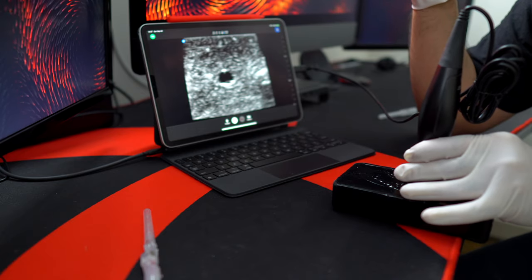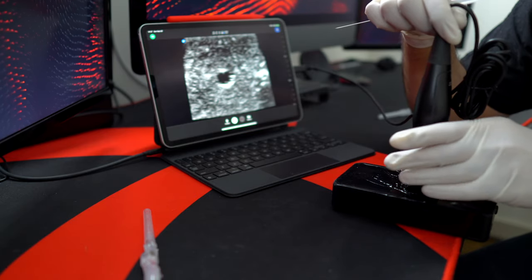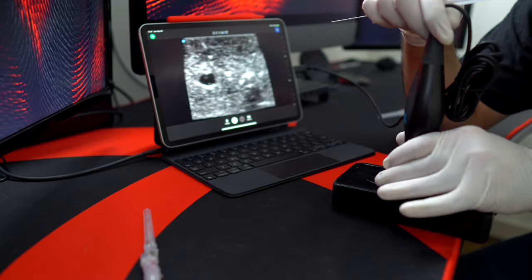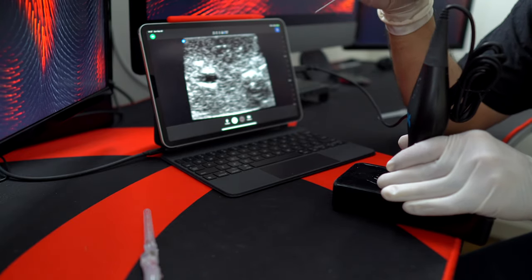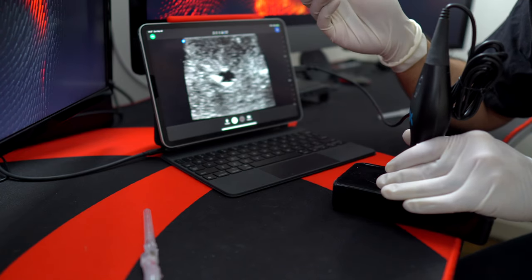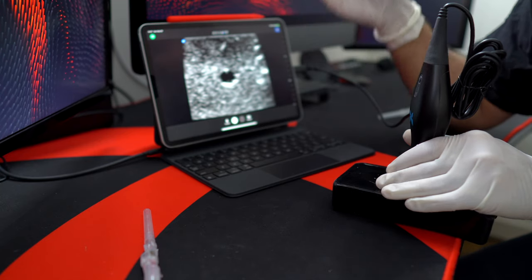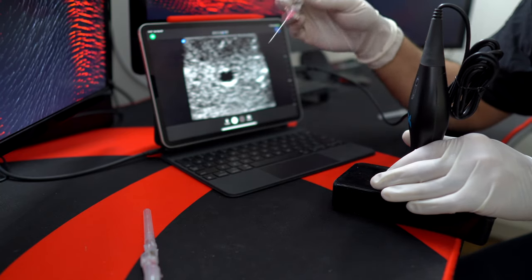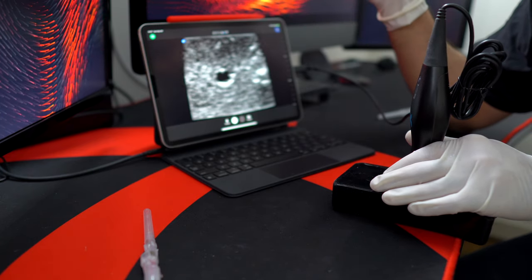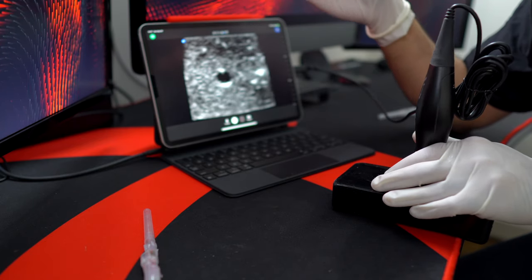The last thing I want to do before actually sticking is stabilize my wrist. If I'm working on a patient, I grab the ultrasound and use their body to stabilize my hand. This hand should not move at all during the procedure. You don't want both your needle and ultrasound moving simultaneously — only one at a time. Now I've got a good target on the screen, my wrist stabilized, gain and depth optimized, and I know which side is right and left.